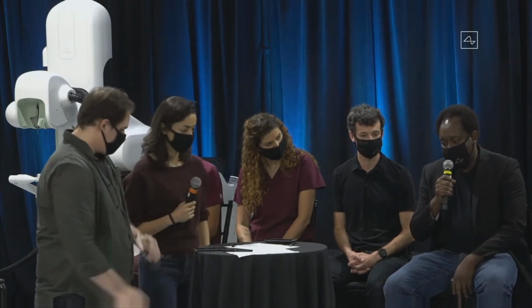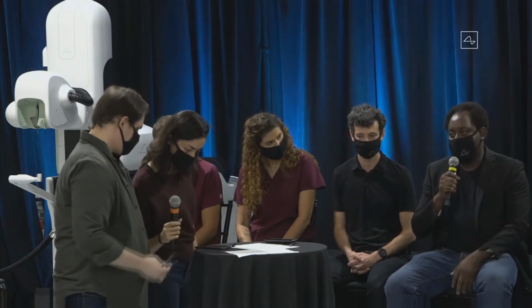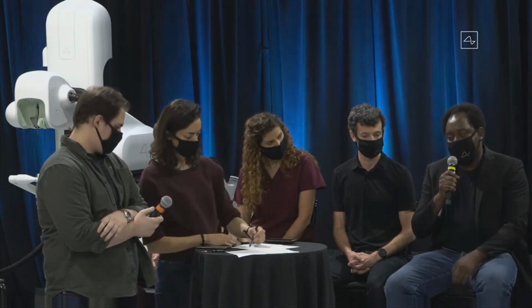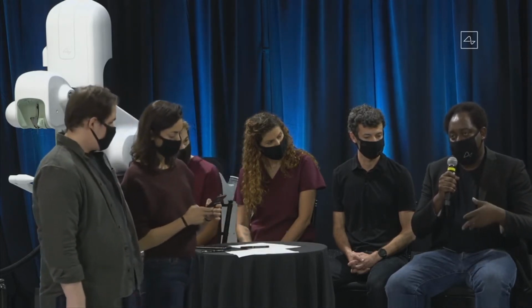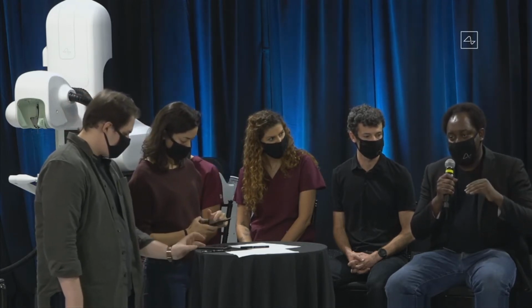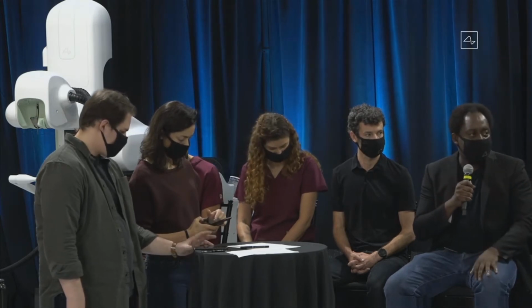My team is made up of a group of process engineers and material scientists. And our job is to make the tiny wires, as Elon referred to them, what we call the threads that are implanted in the brain. And of course, the threads are made of conductors and insulators. And choosing the right material that is amenable and compatible to the brain is something that our team has expertise on, and we work seriously on interface engineering just to make sure that our layers are well thought through, well designed, and at the end of the day, when we implant this device, they'll be functional for either reading or for writing in the brain.